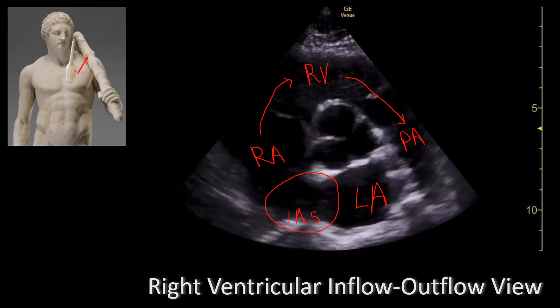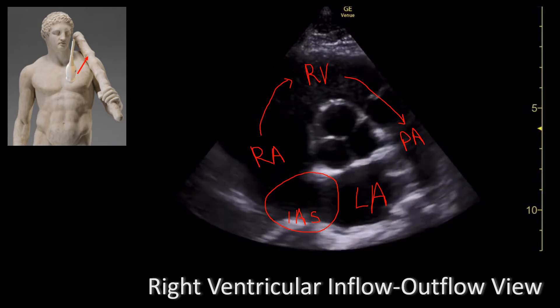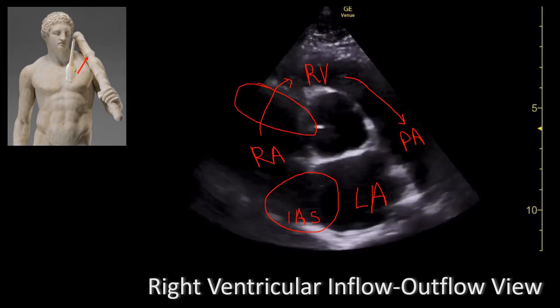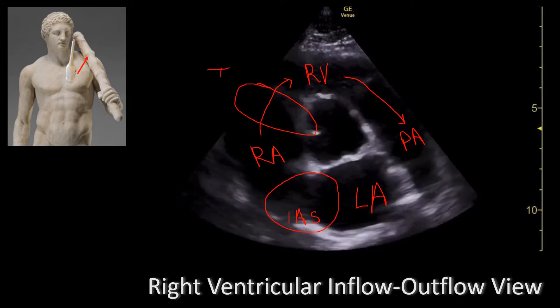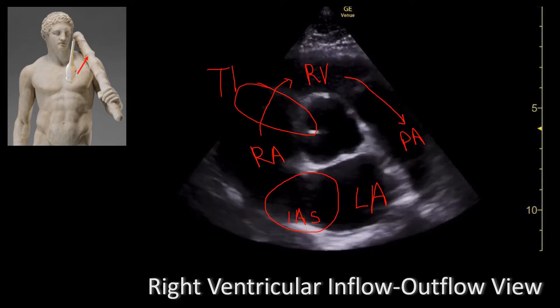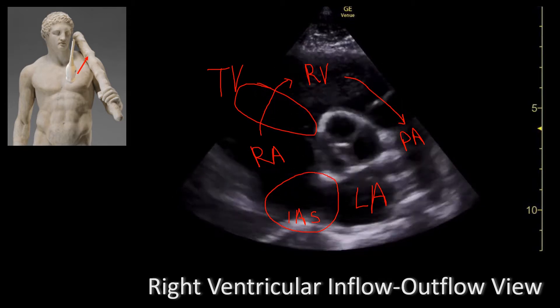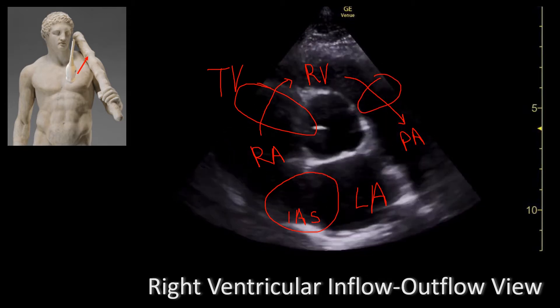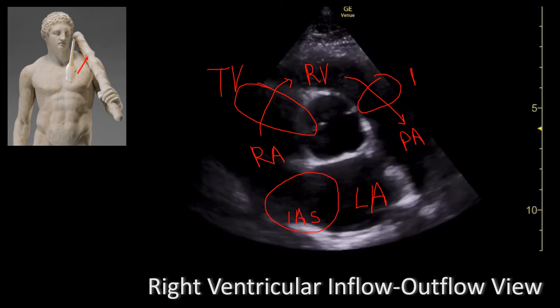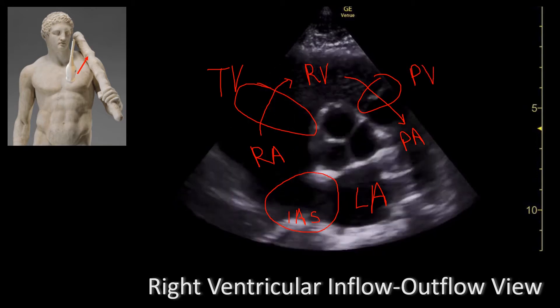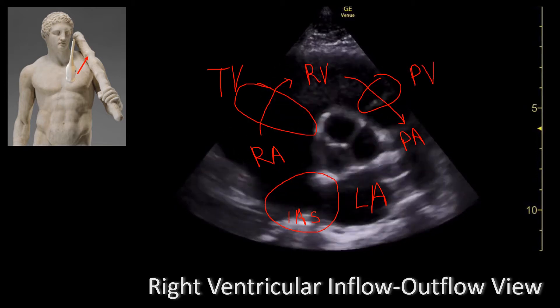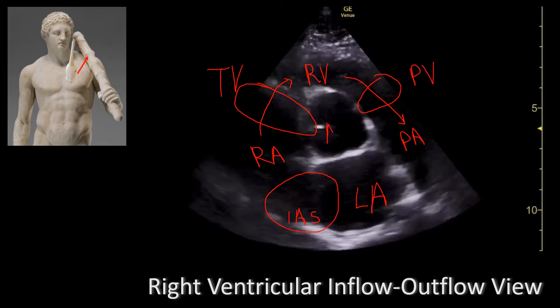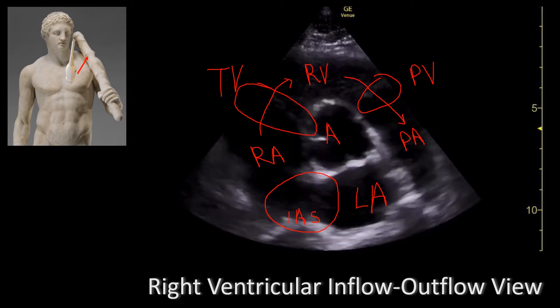Let's talk about the valves we're looking at. Between the right atrium and the right ventricle you have the tricuspid valve. And between the right ventricle and the pulmonary artery you have the pulmonic valve. The valve that's right in the middle of the screen is going to be the aortic valve in short axis view.